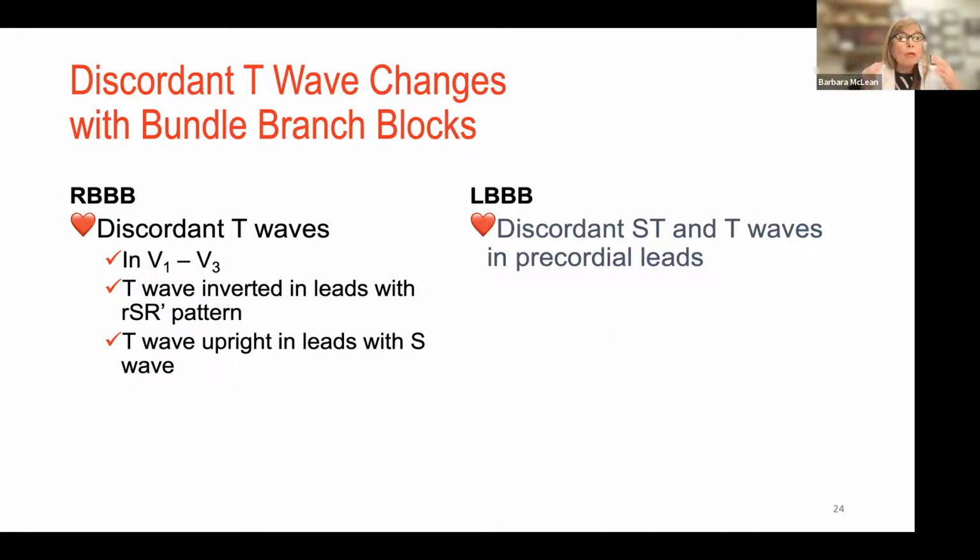So remember, you're going to expect the T waves in the opposite direction in the leads that are designated for that side of the heart. Okay, so I'm again going to remind you, V1 represents the right heart, V6 represents the left heart. Now it's really V1 and V2 and also V5 and V6, but we're just going to choose those two leads to say, I'm going to compare V1 and V6, assuring that leads have been placed correctly, because that's a big boo-boo that can happen.